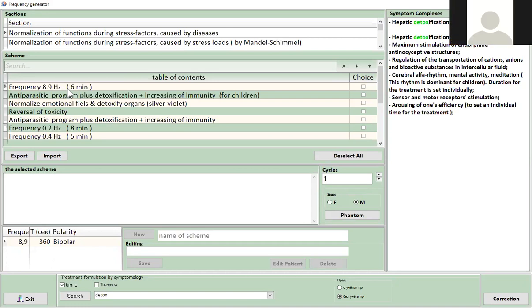So you can program all 7 strips at one time? Yeah, absolutely. Does it matter what kind of tape they use to put the magnetic strip against their skin? It doesn't matter. It's better to be more comfortable, so it won't be itching or something.